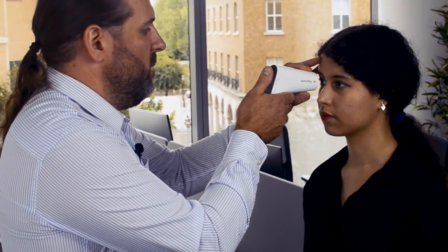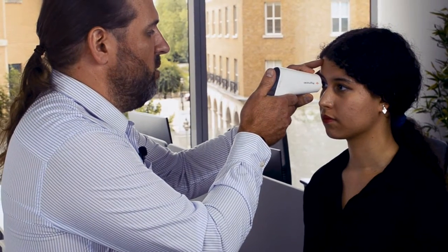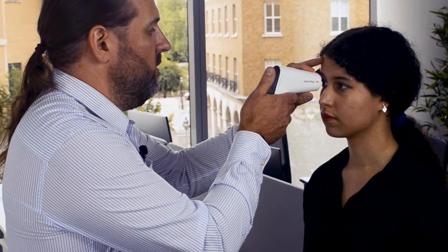The PM1 is a very easy to use device with a touchscreen on the back. You simply put the device in measurement mode, offer it up to the patient's eye. The device will automatically start scanning when it's aligned and then display a measurement on the screen.